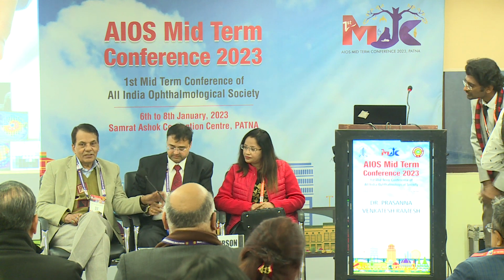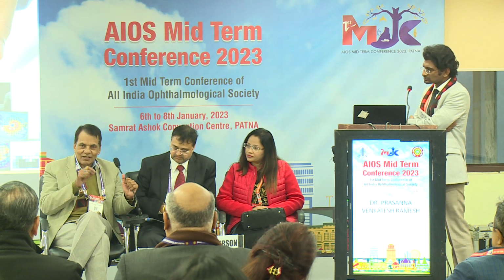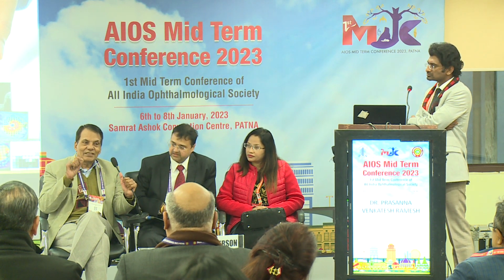But one message which I want to give to everyone, that OCT, whenever you are doing, probably he also said that last sentence, it should be always done on the same machine. Because there is no point doing it once in this clinic, second some other clinic, then some third clinic, because then you cannot compare at all. And that is the main function of OCT according to me in relation to glaucoma. Yes, sir.